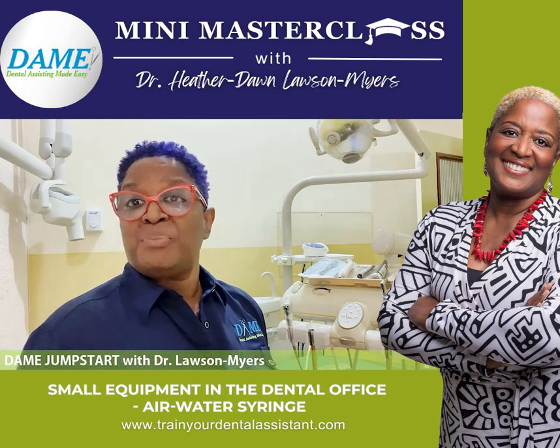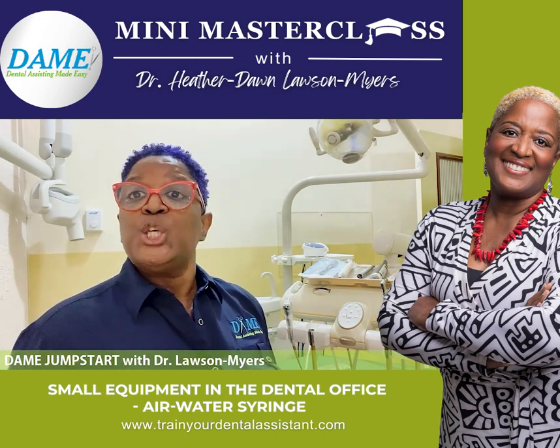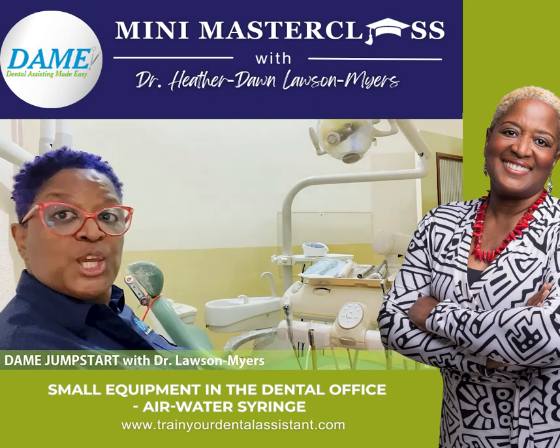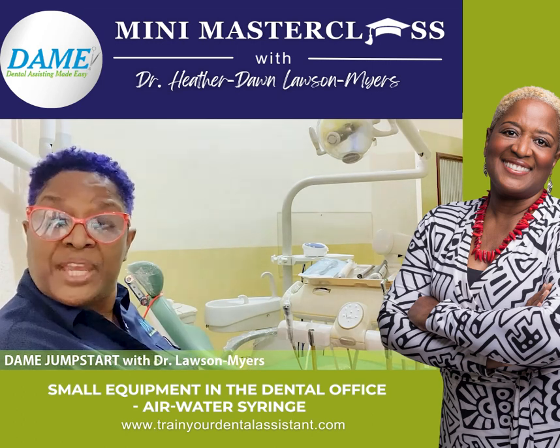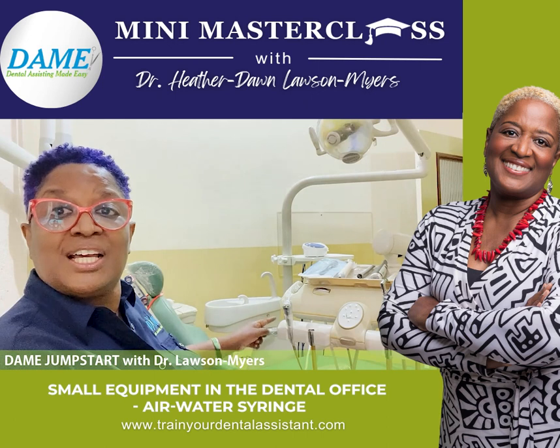That's where we provide treatment for our patients. If you look just beyond here, you will see an x-ray machine. And if I shift this way, you can see the patient chair where our patients are comfortably seated for treatment.